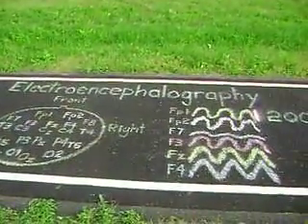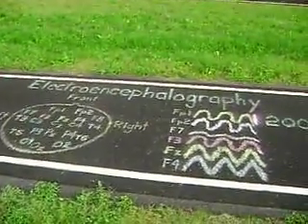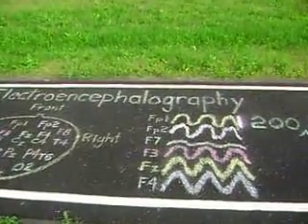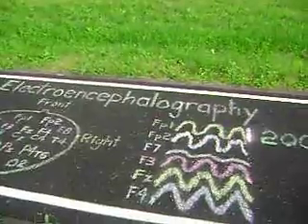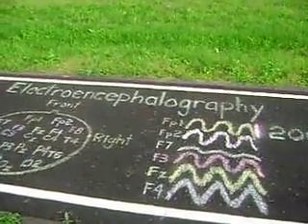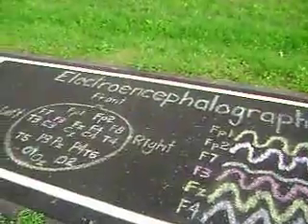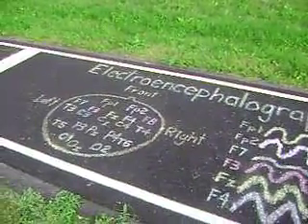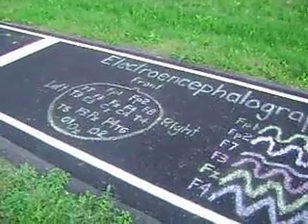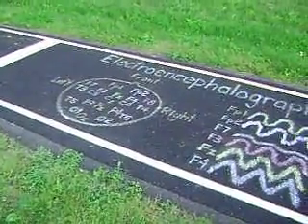Coma. Findings include lack of normal background, reactivity, or state changes in combination with continuous generalized polymorphic delta activity, FIRDA, low voltage patterns, periodic discharges that include PLEDs, or triphasic waves, or burst suppression pattern. In patients with coma following seizures, electrographic status epilepticus should be ruled out. Alpha coma with generalized, invariant, unreactive alpha frequency activity is associated with toxic or metabolic insults and cerebral anoxia and must be distinguished from normal alpha rhythms present in those with a locked-in state.